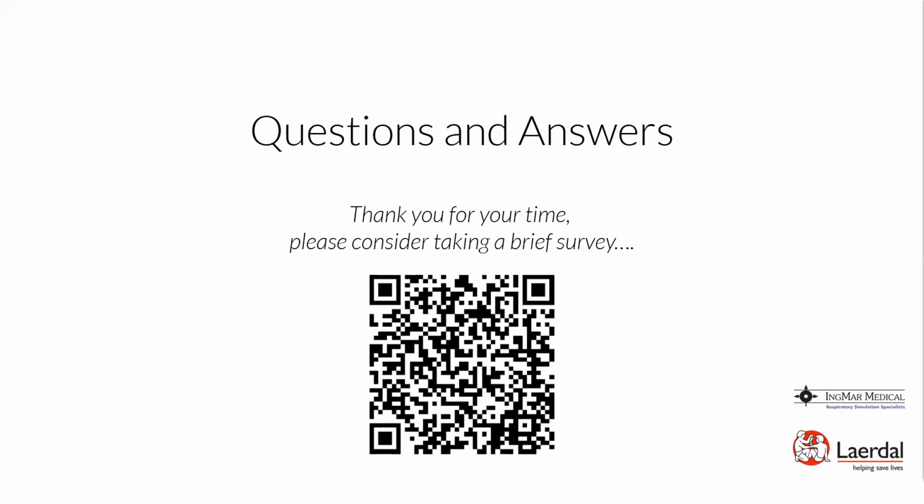Thank you. I would like to clarify something, and I'll use this question as a way to do it. Someone was asking whether the ventilator shown in the scenario was a simulated ventilator or a real ventilator. To be clear, we are using real ventilators, and you would use the real ventilators that you have in your organization for performing these simulations as well. The follow-up question was, why are you changing the lung settings when the patient is intubated? Jess, I'll let you speak to that, but as far as I'm aware, if anything, we would have just made the lung model to where the patient was no longer breathing anymore, and that would have been the model that we changed it to.